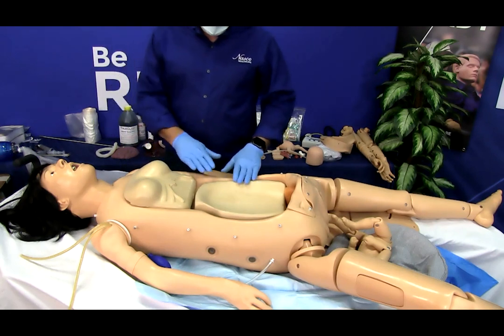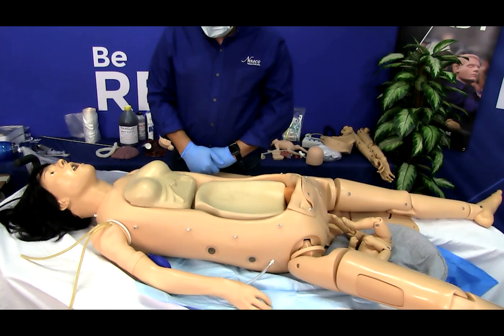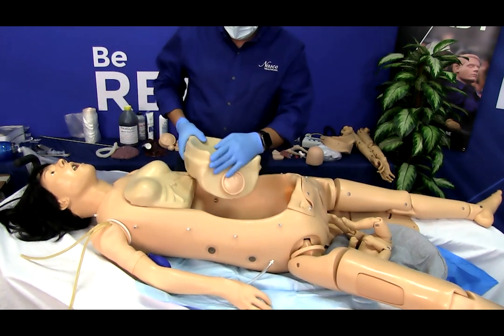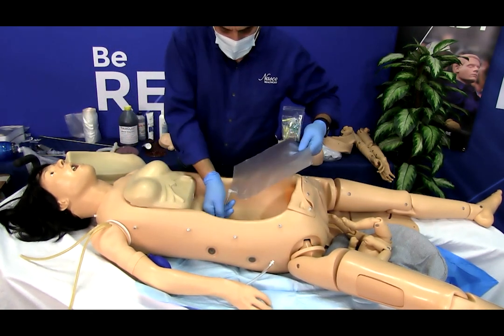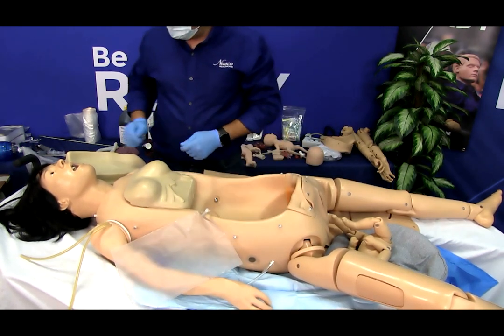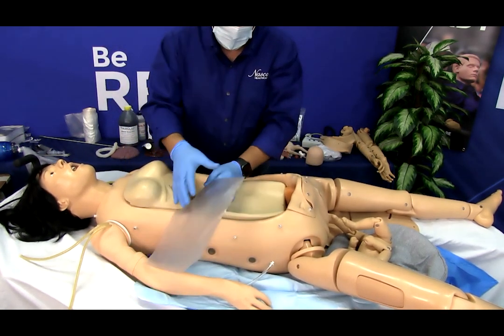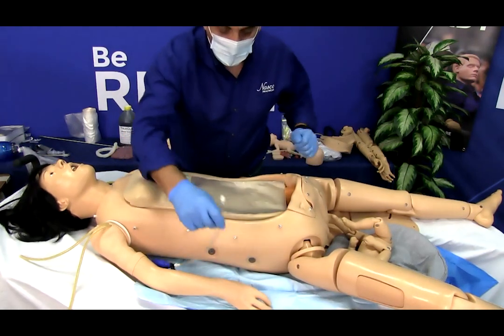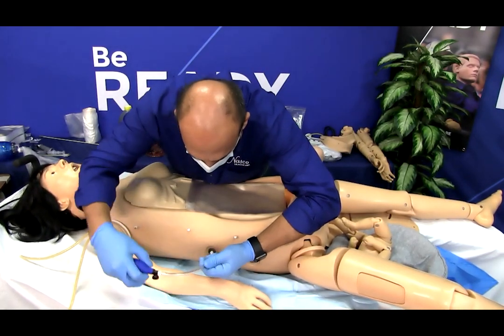To set up your simulator for Leopold maneuvers, install the fetus and prepare for delivery simulation. Remove the pelvic block. Attach the positioning bag to the upper port on the inside of the torso. Place the pelvic block into the torso and lay the positioning bag lengthwise over the block. Attach the inflation tubing with a squeeze ball to the upper side port on the outside of the torso.